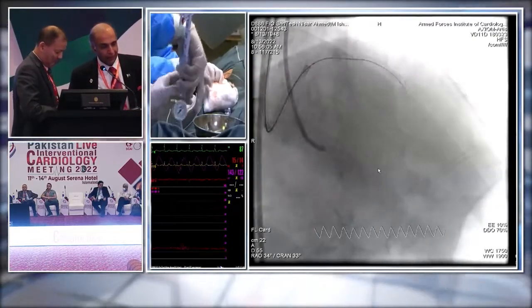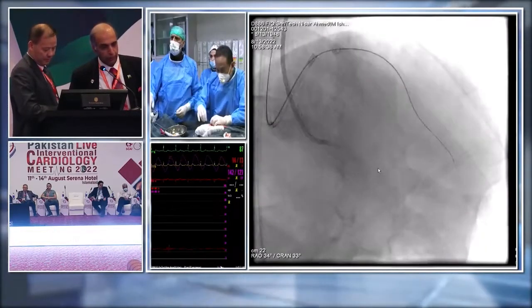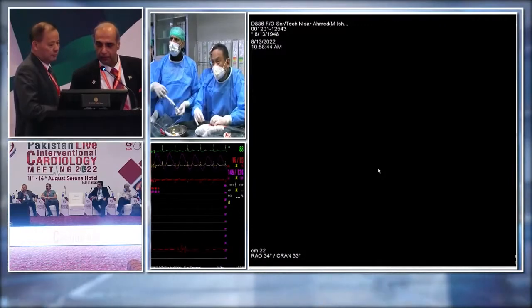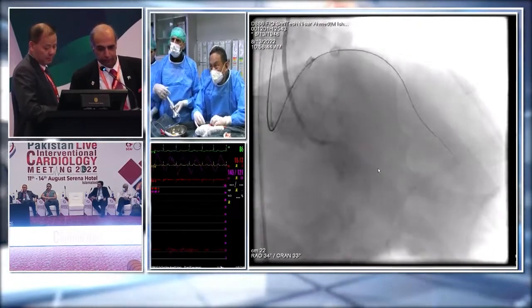Good morning. Great. We don't very frequently use these trapping balloons over here. Mostly when we are using it, we use the pressure device over there, the inflation device, and we maintain the pressure and do that trick. What is your take? Which one do you prefer?